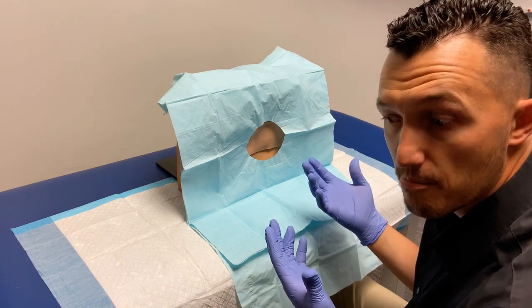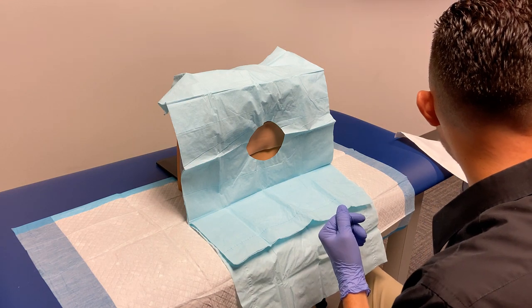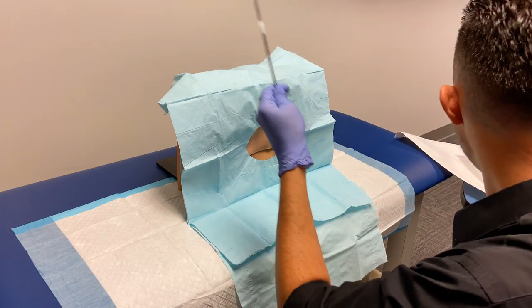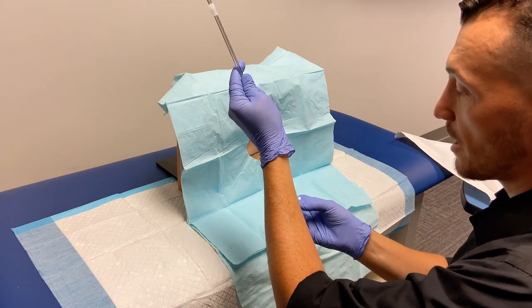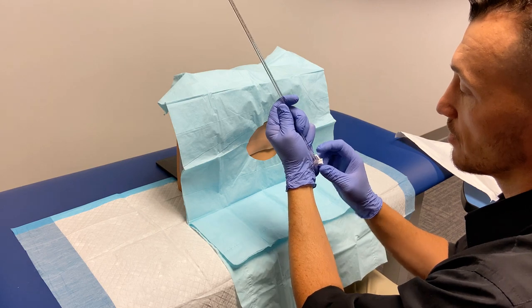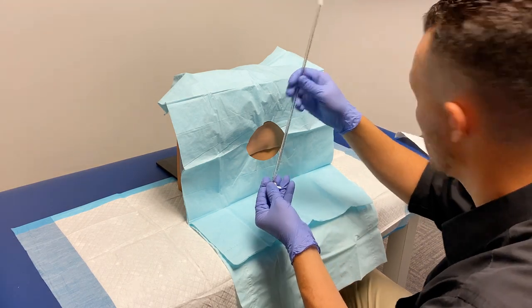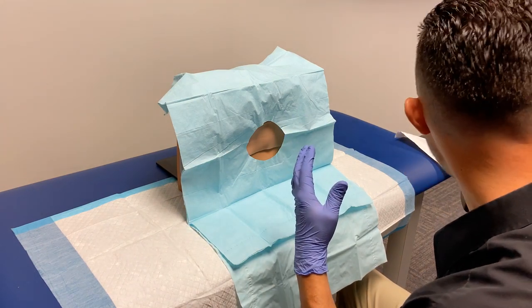At this point the manometer should be all set up — the manometer with the extension piece on top, the stopcock connected to the bottom. Make your stopcock generally closed to the back open end. Have everything ready and lying in a sterile position on your tray.